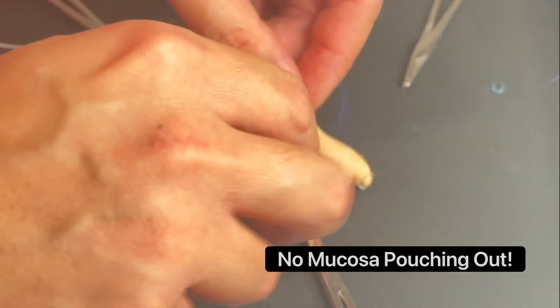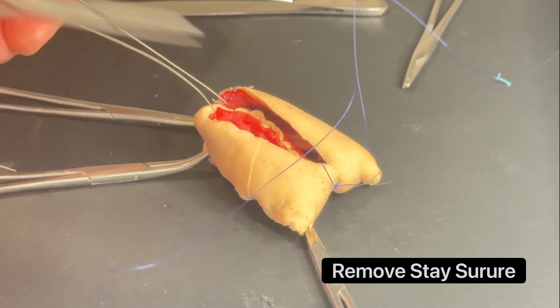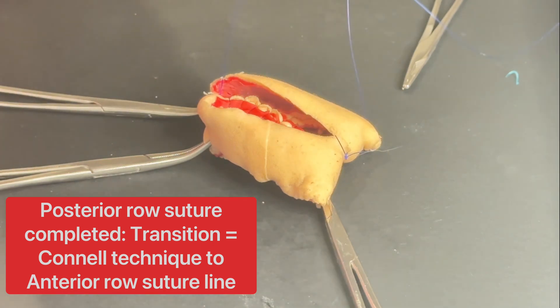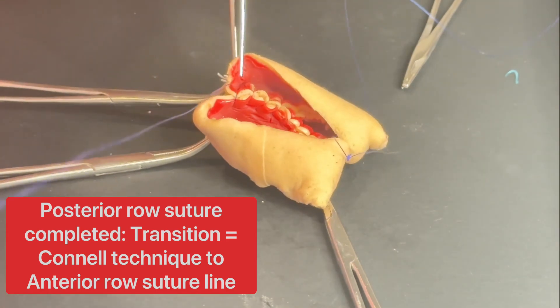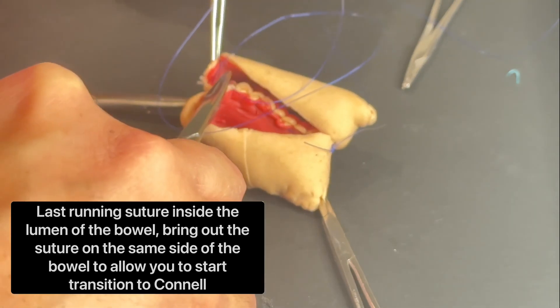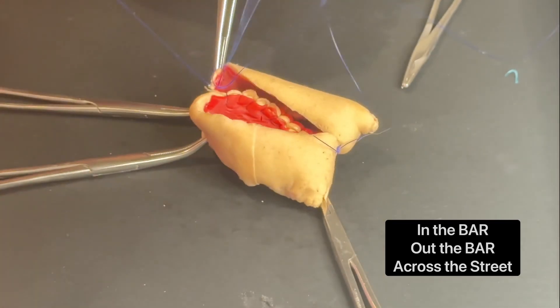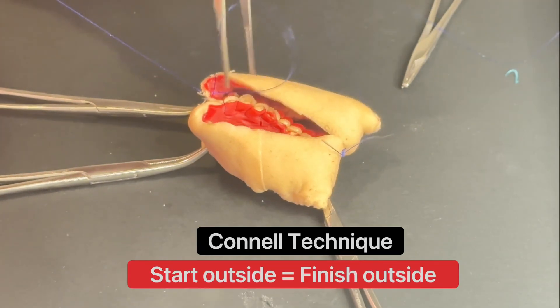With our posterior row completed, we're going to tighten this one and guide it so it doesn't bunch up. When we look at our posterior row, it's actually imbricated inwards, and if you look at it from the other side, it looks very nice — no mucosal outpouching. Now I can take off my stay suture and move towards the anterior row. When moving towards the anterior row, this is where we change to a Connell stitch. People say 'in the bar, out the bar, across the street' — I just tell them you start outside and you finish outside.